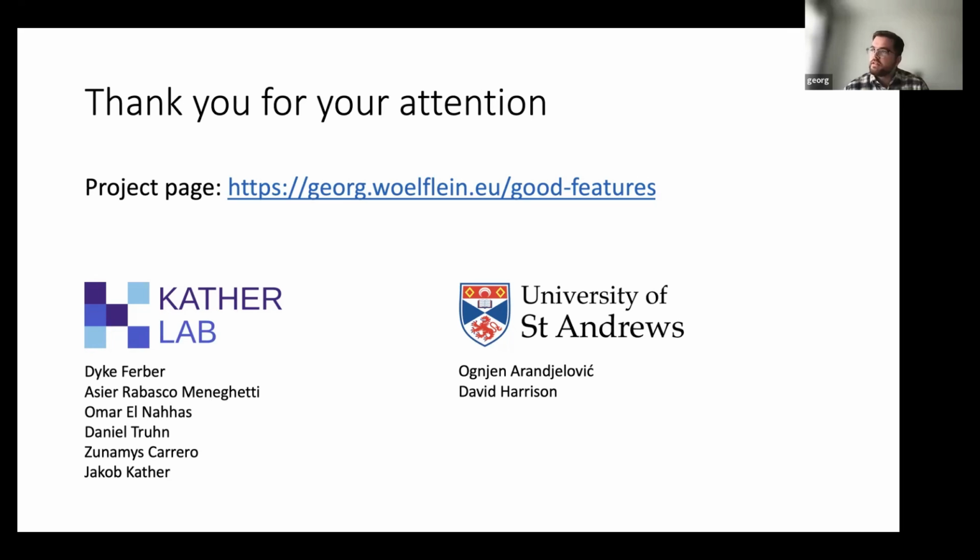We only looked at a patch size of 224 by 224 pixels, because that was also what all the feature extractors that we compared used as the input dimension. So I can't speak to that.